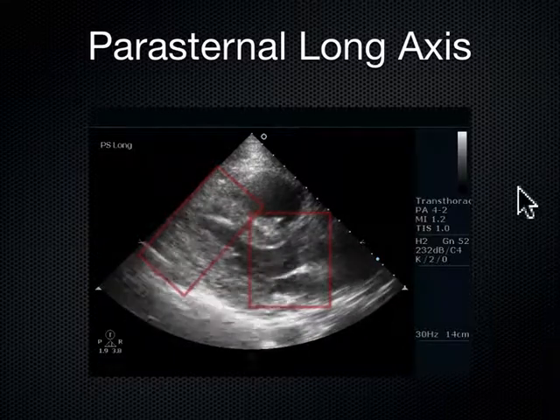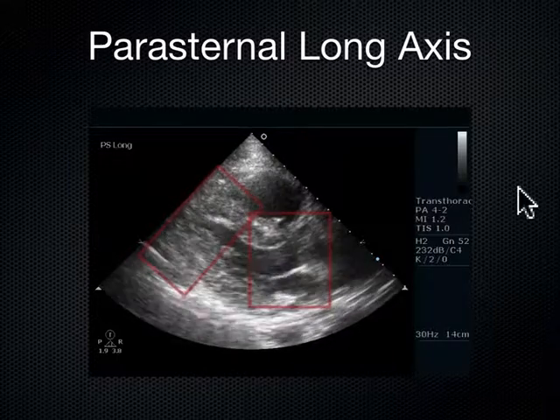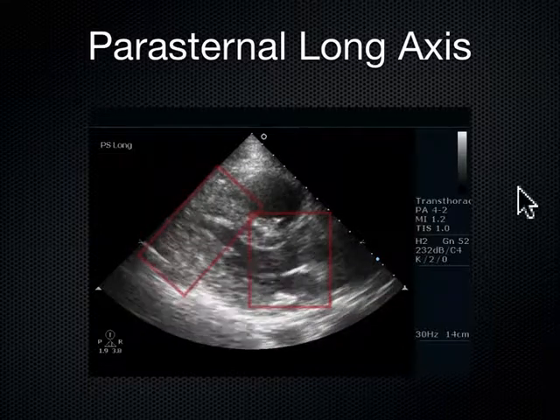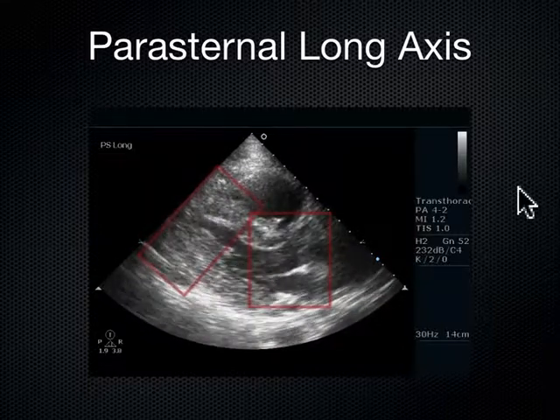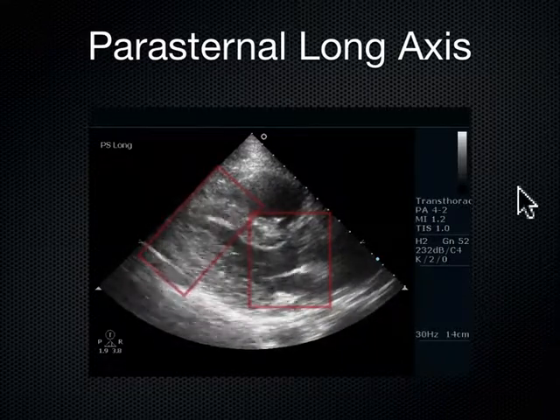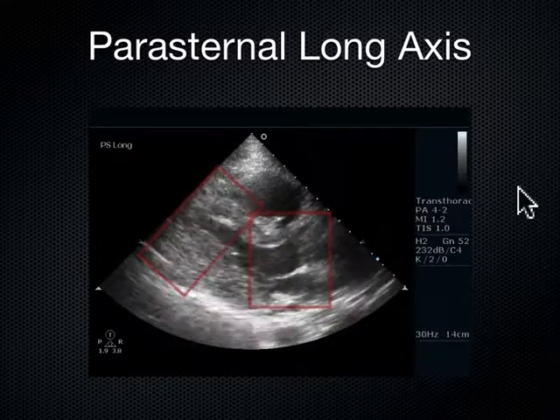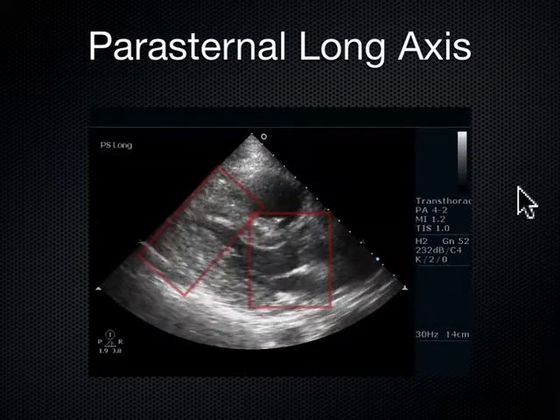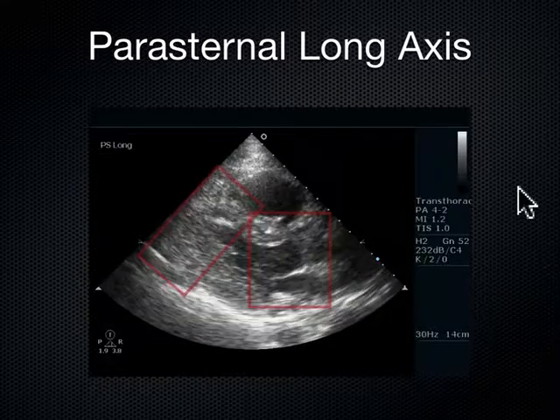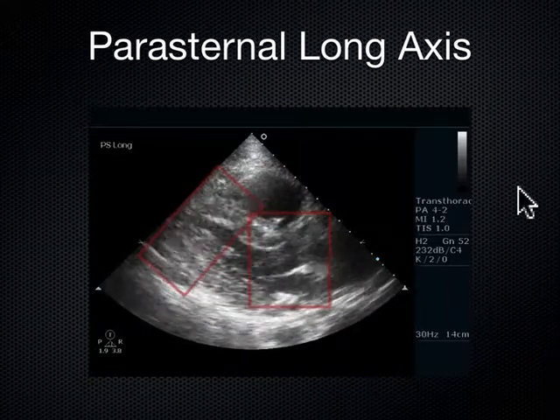What would cause that? The right ventricle is trying to pump blood to what organ? The lungs, right? So the blood's trying to get out to the lungs. If the right ventricle is straining so hard to push that blood out to the lungs because something in the lungs is not letting it get there, like a blood clot, a pulmonary embolism, the right ventricle just starts to get bigger and bigger. We call that RV strain. And RV strain, one of the first life-threatening causes that comes to mind, is something I can treat with thrombolytic therapy in the setting of hypotension. In the setting of shock, thrombolytics are indicated. And on this patient right here, we did give them thrombolytic therapy, and they actually did have a blood clot in their lung, and they survived.